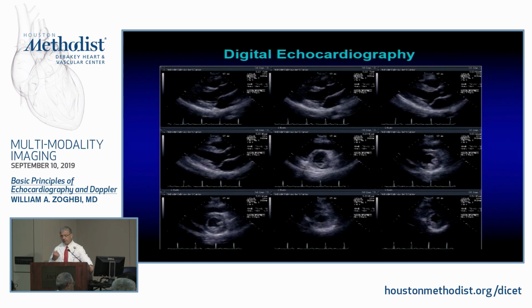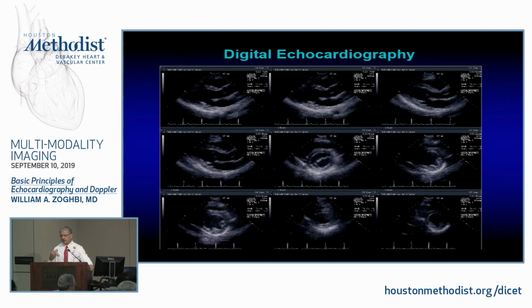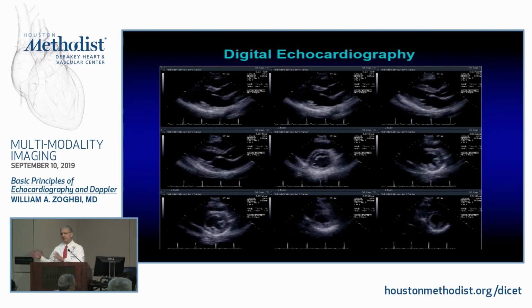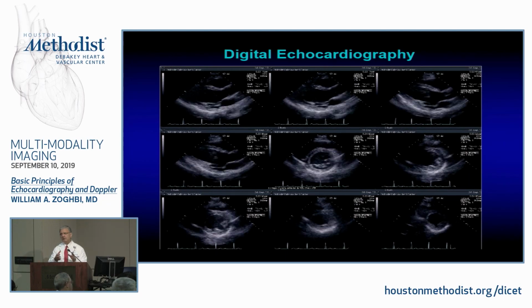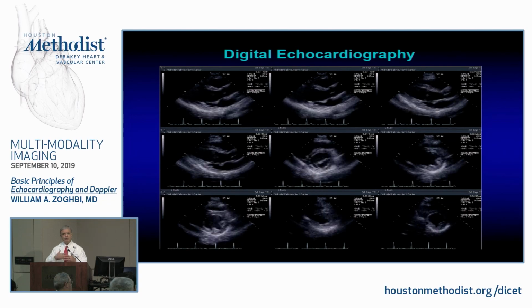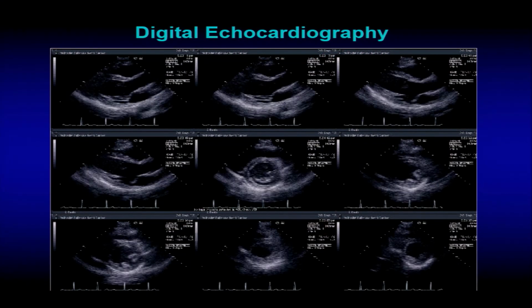Digital image storage, I know we take it for granted, but I'll tell you why it is so important. And for you is ultrasound as opposed to CT and MRI, okay? Ultrasound is very dependent on the person who's taking the image, unless you're dealing with 3D acquisition. With 3D acquisition, I can change the planes. This is the whole heart, I could change it. But the imaging is still not perfected as well.